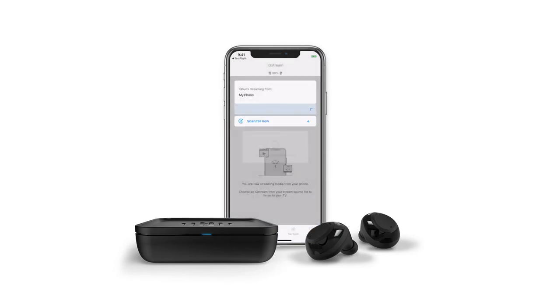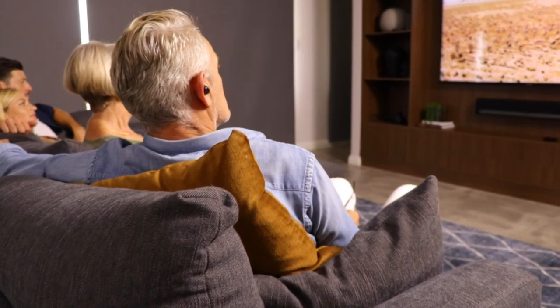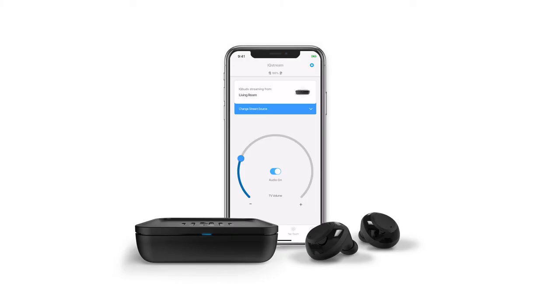You will land on a screen that says you are streaming audio from your phone. Below this will be a list of your connected devices, and you will see the IQ Stream with the name you just gave it. If it doesn't show up, please give it a few seconds. Tap the IQ Stream you just named and allow it a few seconds to connect. You will then see a screen where you can control your own TV volume through your IQ Buds Boost. You can turn the volume up or down, or mute it. It's important to note that this will only change the volume of what you are hearing through your IQ Buds, not the external TV itself. When you want to listen to music or media from your phone or take phone calls, open the stream source list again and select the name of your phone.